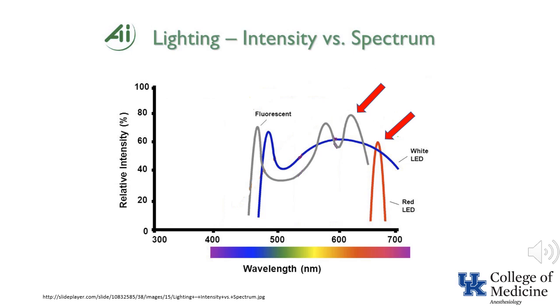In fact, the resident had already left the room to get the patient, so I was the only person in the room. When I entered the room, the pulse oximeter probe was lying on the OR table, and the OR light was also shining on the OR table. The interesting thing was that the pulse oximeter was displaying a plethysmograph and a saturation of greater than 90%, even though the probe was not on a patient. More recently, interference has been reported with the use of the Medtronic Stealth Station navigation system. As previously noted, simply covering the probe almost always eliminates the interference.